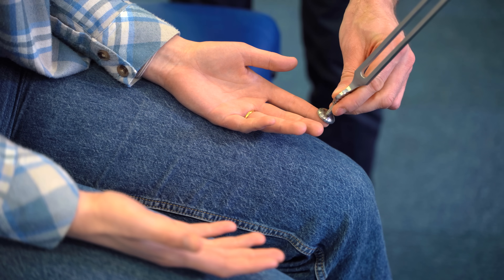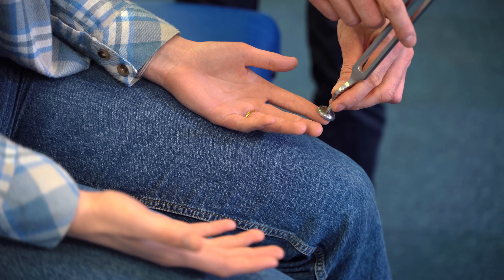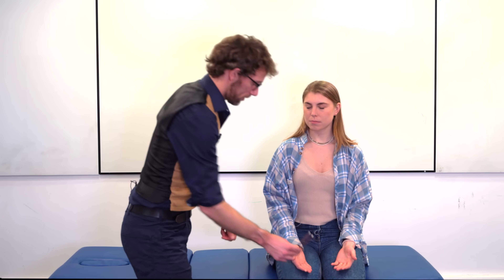Striking the tuning fork and placing it over a bony prominence, such as the distal phalanx — please close your eyes and tell me when the vibration stops. The very act of applying the tuning fork to the finger may be sufficient to stimulate the patient's sensation of touch, which would provide a false positive. So we stop the tuning fork and ask the patient to confirm when they can no longer feel the vibration.